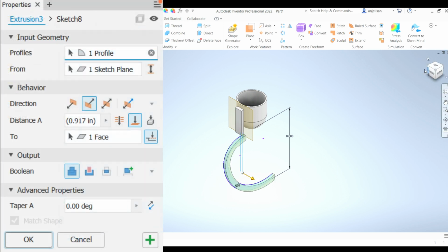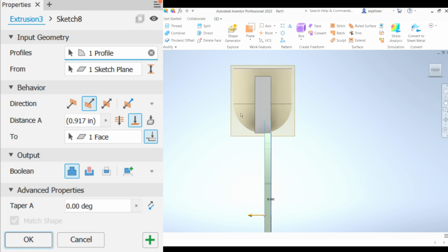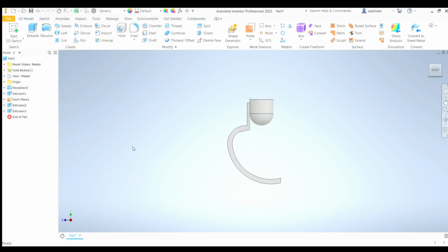So I hit the extrude function, and I make sure it's going in the right direction first of all. So I flip it, and then let's say I don't remember how wide this rectangle is, so I could just select To and then hit this edge of it. It automatically makes it as thick as this is wide. Okay, so now we have a rough sketch of our cheetah blade.